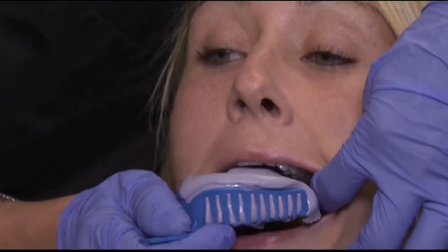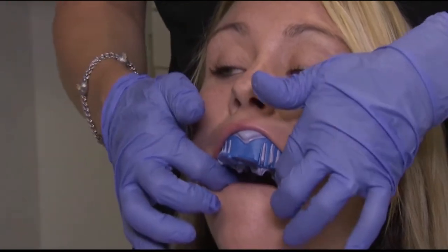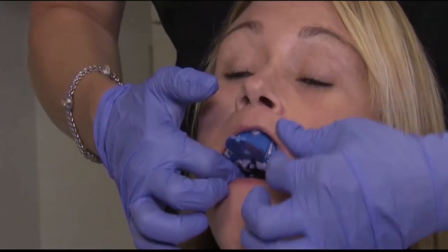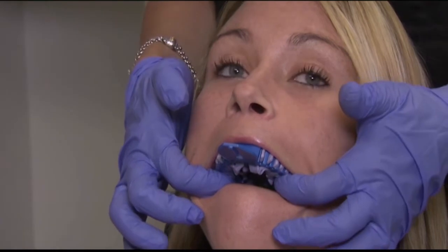I'm going to seat that right back in where I was because I remembered where I had placed it. And again, if you're off a little bit, it's okay because my impression is coming from the Correct Flow wash, not from the putty itself. I'm right back where I am. I'm not moving around, and I am just going to hold that until it sets up.